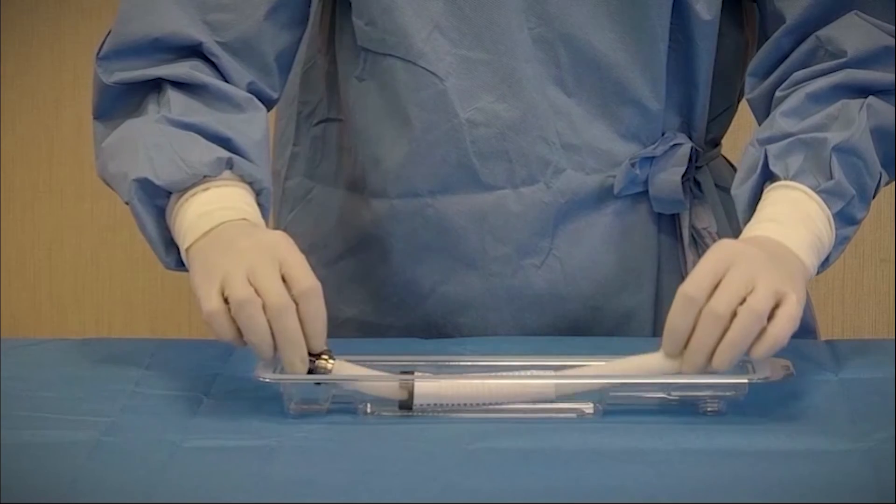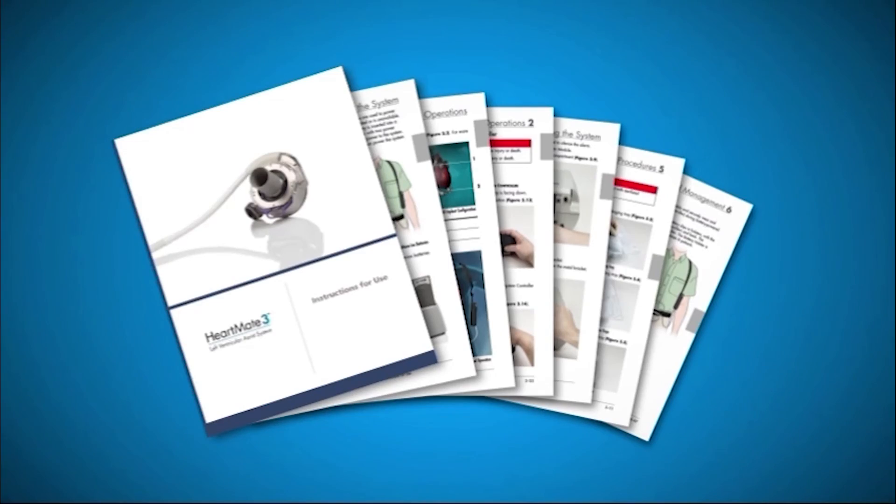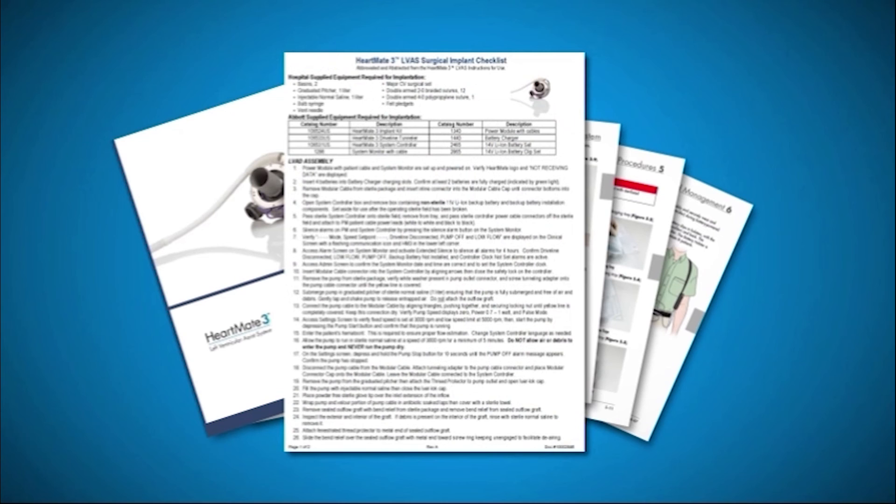Place the graft back into the tray and cover it with a sterile towel. Refer to the HeartMate 3 instructions for use packaged with each implant suitcase, or the HeartMate 3 surgical implant checklist available from Abbott, for more information.